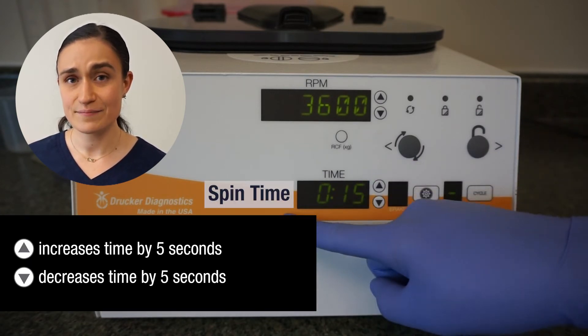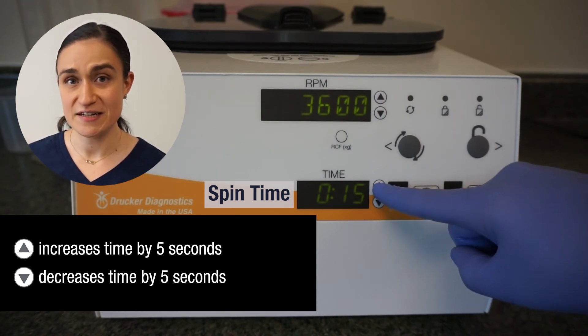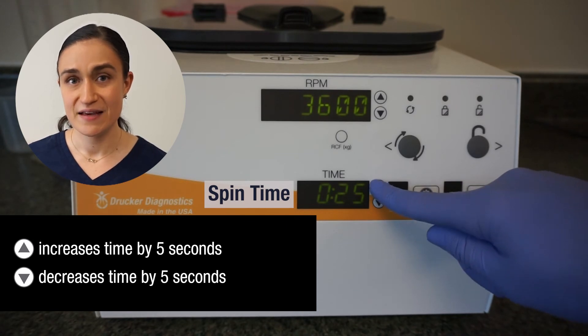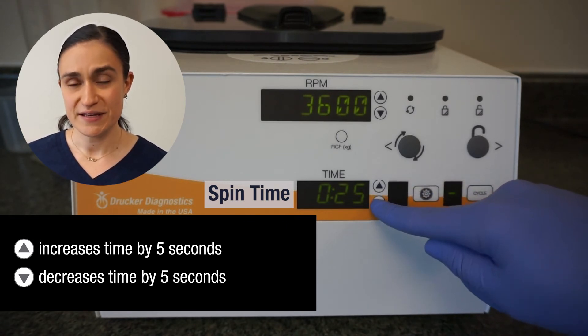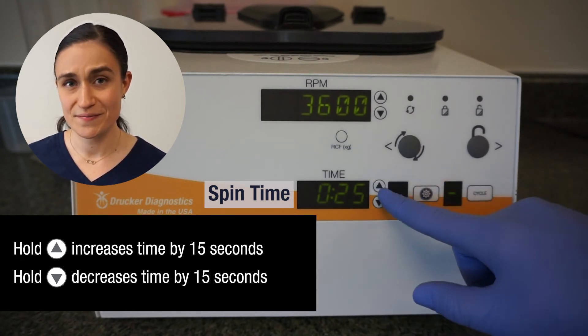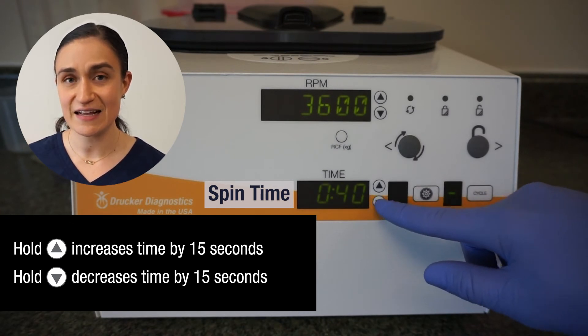The time display screen shows the currently selected time. This can be adjusted in the same way the RPMs work, using the buttons next to it. A single press will increase or decrease the time by 5 seconds. If you press and hold, that will increase or decrease the time by 15 seconds.